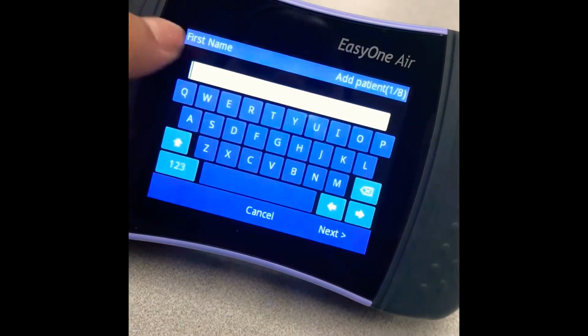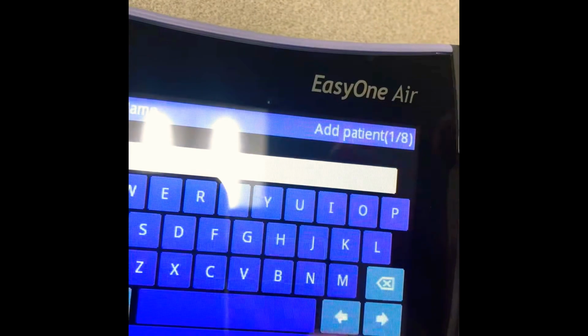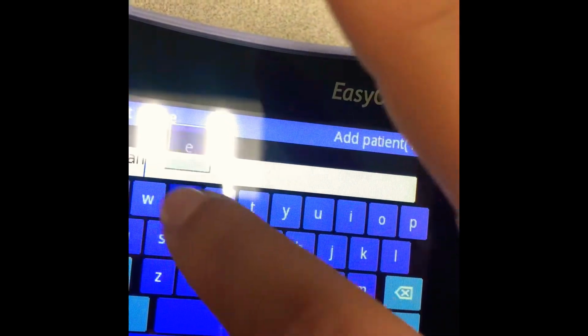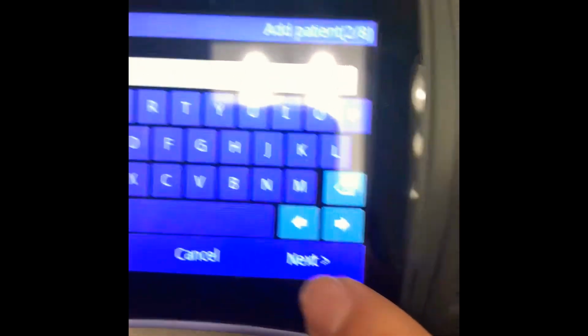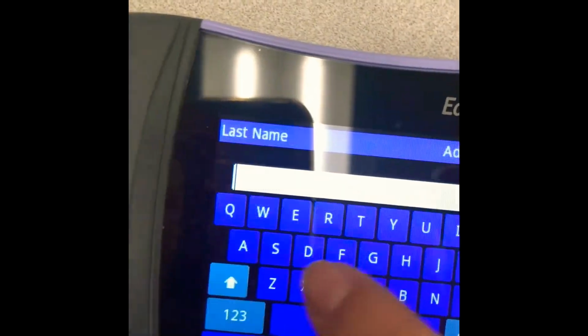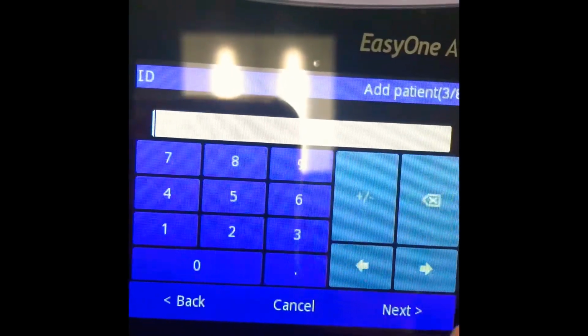So I'm going to add patient. Right here I'll add a random one. Jane. Go to next. Doe. Next.